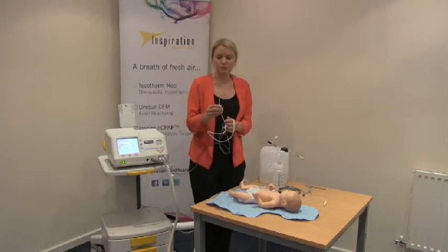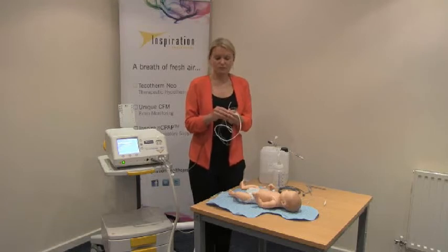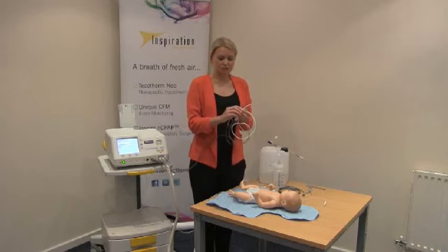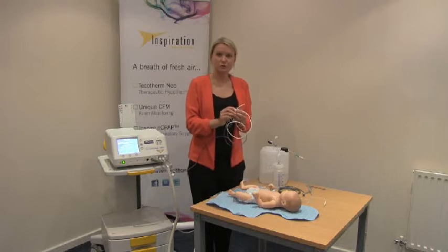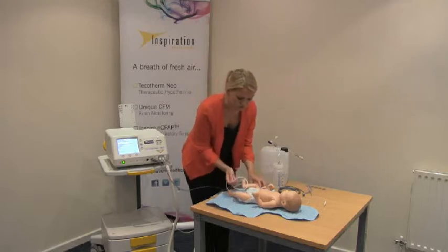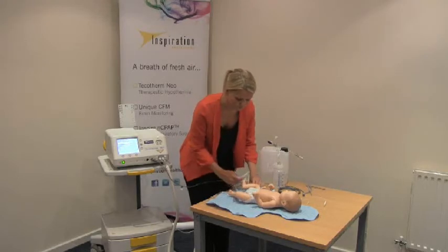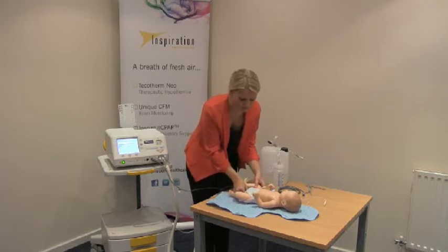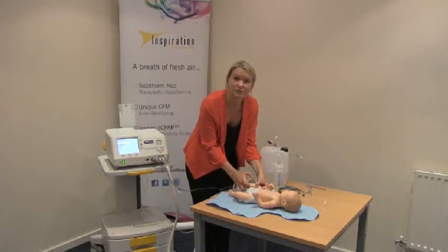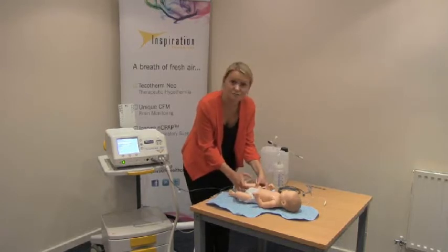The rectal probe will need to be inserted into the baby. This will be inserted between 2 and 5 centimetres depending on your clinical practice. We need to put a little bit of tape onto the probe just to show how far we should insert it. So we can insert the probe into the baby, and it's a good idea to secure it with a little bit of tape on the inner thigh.